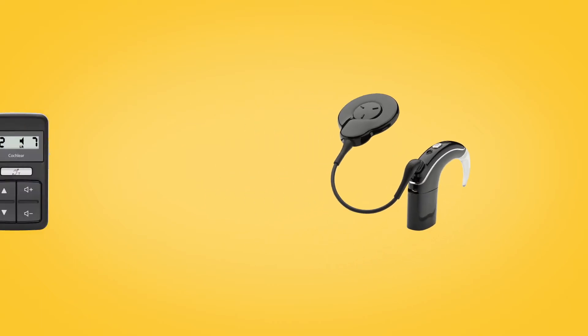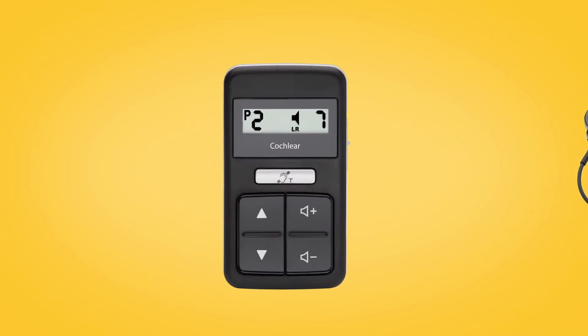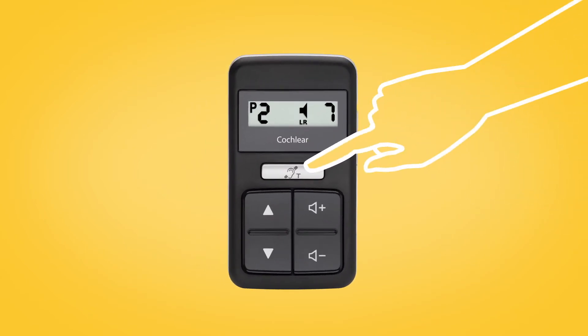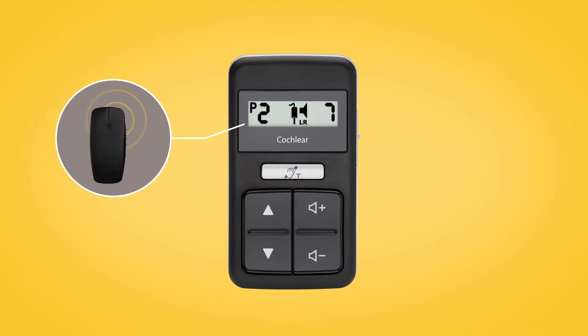You can also control and monitor True Wireless accessories using the CR310 remote control. Once paired to your Nucleus 7 sound processor, press and hold the silver telecoil button for two seconds, then release. Your processor will start streaming from your mini microphone or TV streamer and the accessory icon will appear on the screen.